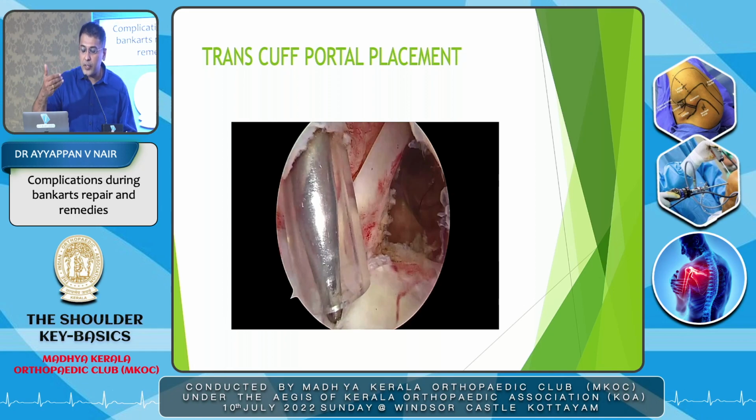So you can put a shaver through the anterior, and let the scope be there. You can even blindly touch both and then take it slightly back, and start turning the shaver independently with the suction. It opens up, closes up, and in 2 minutes it will clear up. So don't panic if it is actually bleeding inside. It is okay, the pump can stop, the fluid can stop, but we can manage. But never take the scope out completely. Maintain the cannula inside.